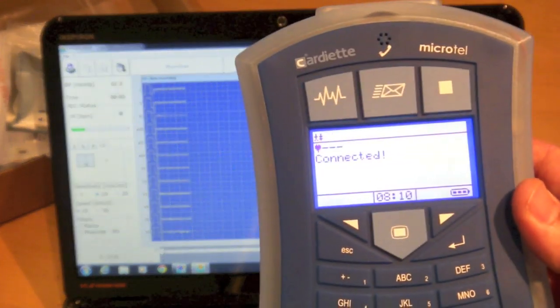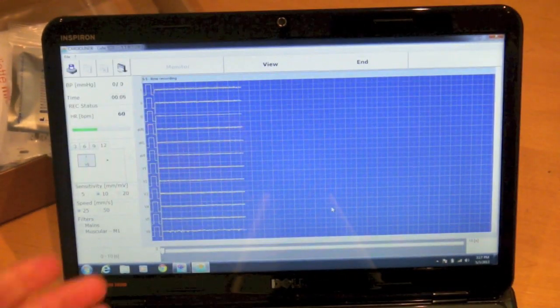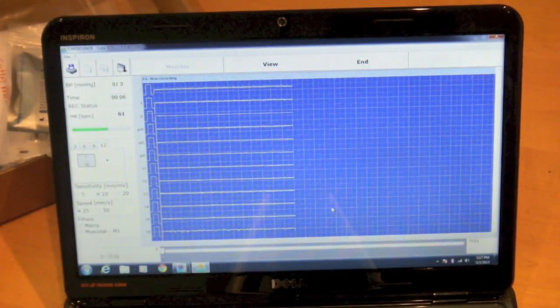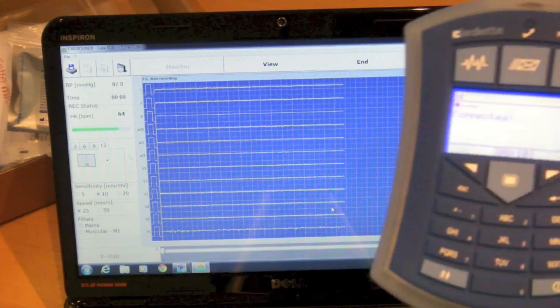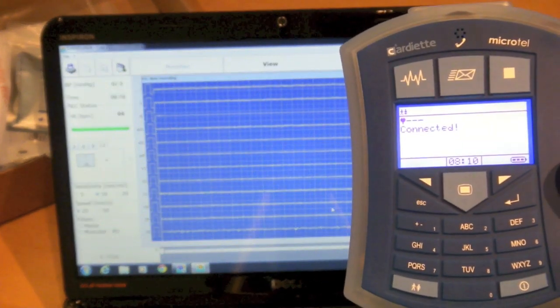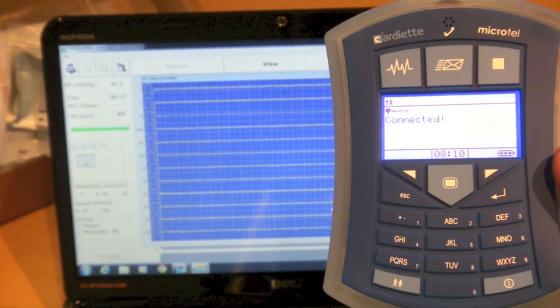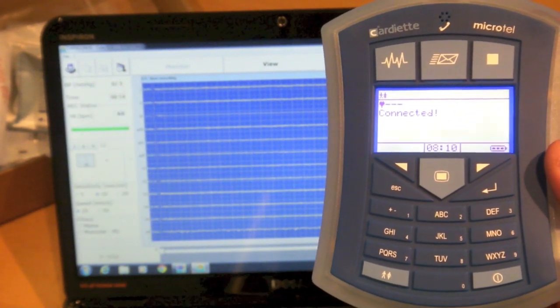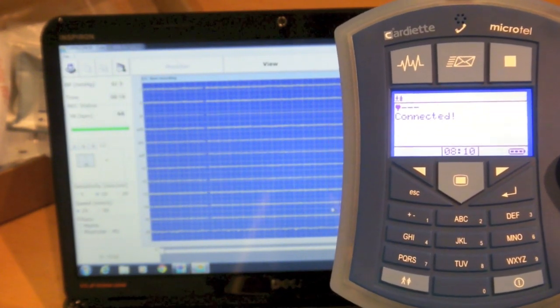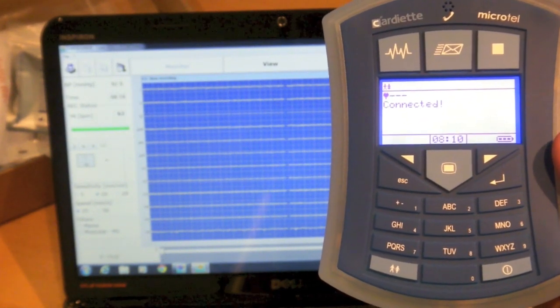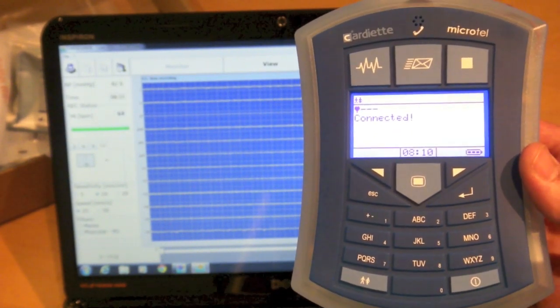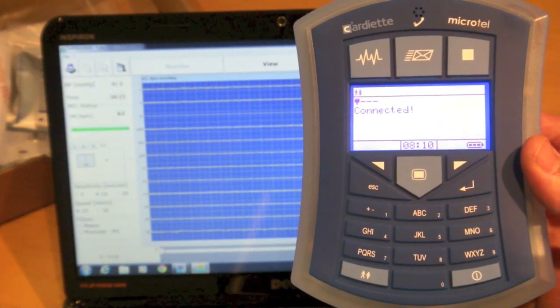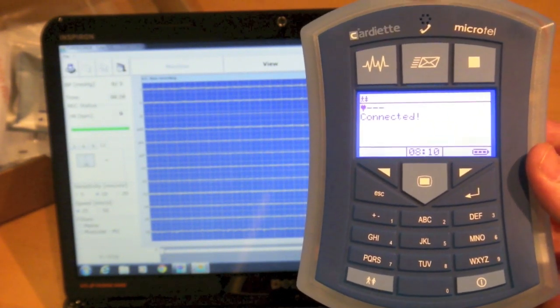At that point it should attempt to connect to the device. Here we do have connected in the device screen and we do start to see a 12-lead preview. This particular device and the Bluetooth technology it's using has the range to work within the walls of most standard sized physician's offices.